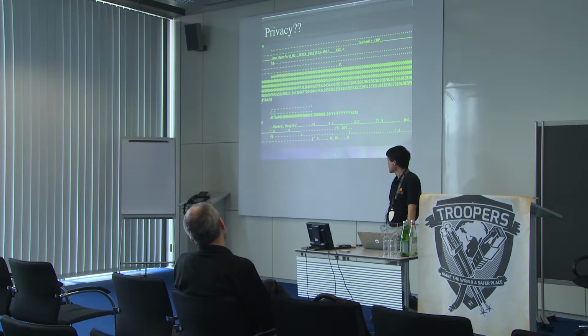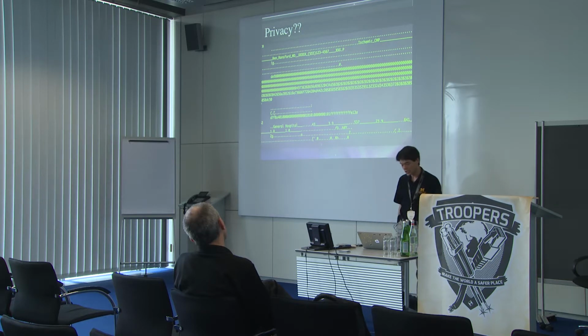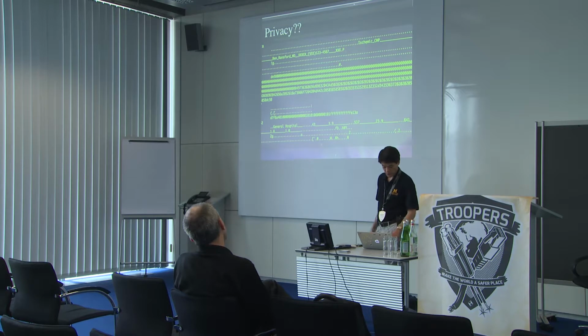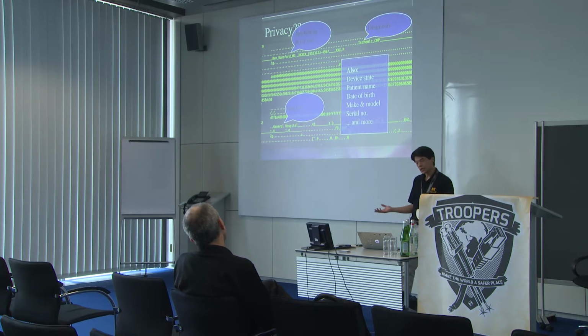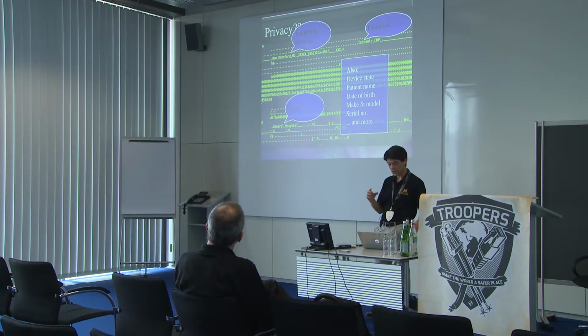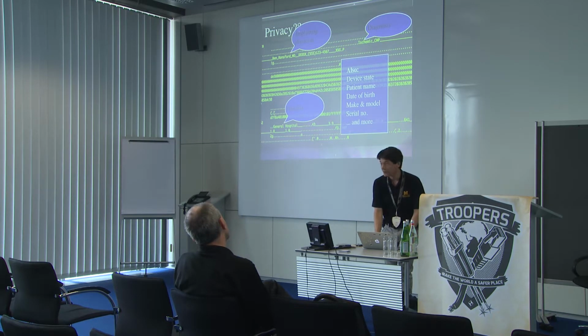You got to keep in mind, these were computer scientists who didn't know anything about electrical engineering. So they did all the symbol decoding, demodulation. They discovered there was no encryption at all on this particular defibrillator. So in terms of privacy, you can see basically everything is in the clear. Using the USRP, software-defined radio, they were able to basically decode everything going on between what the physicians use to program a device and the device, basically an entire electronic health record.